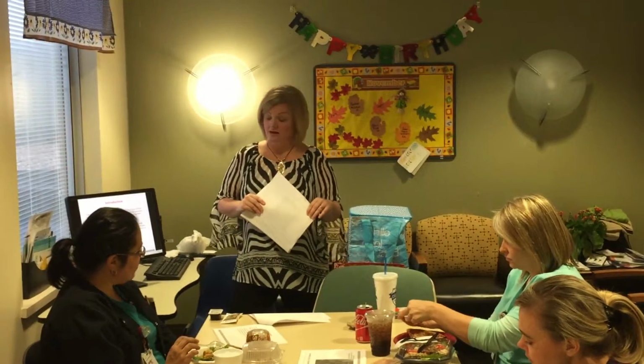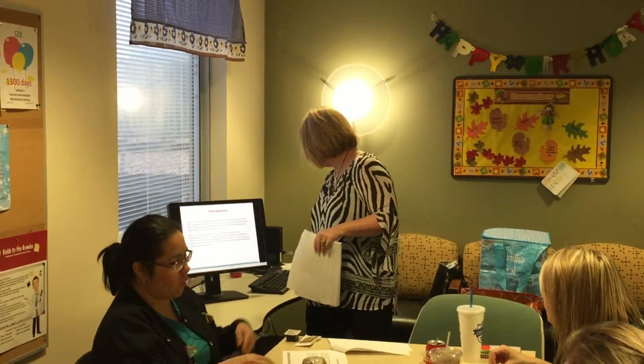So we probably know this, that there are almost 6 million people diagnosed with heart failure in this country each year. And over 100,000 of these patients will become unresponsive to traditional medical management. Due to the lessening number of donor hearts available for heart transplants, the LVAD is now being used as what we call a destination therapy, meaning that people are not necessarily on the list for a heart transplant, but this is their treatment for their heart failure. So this presentation will give an overview of the device and the nursing interventions that will be required to provide excellent treatment to improve patient outcomes.